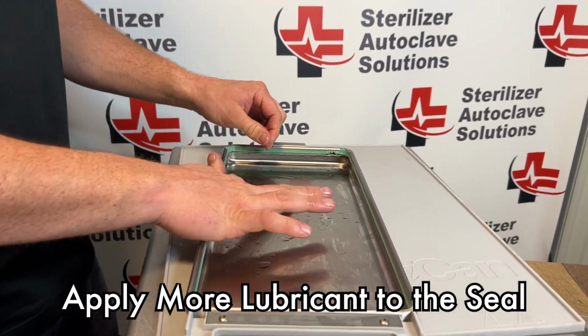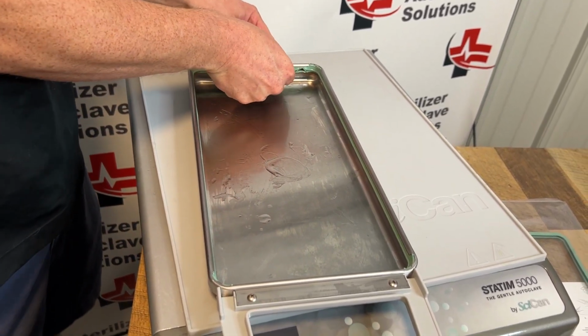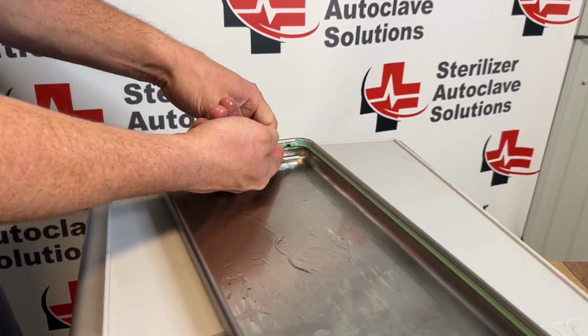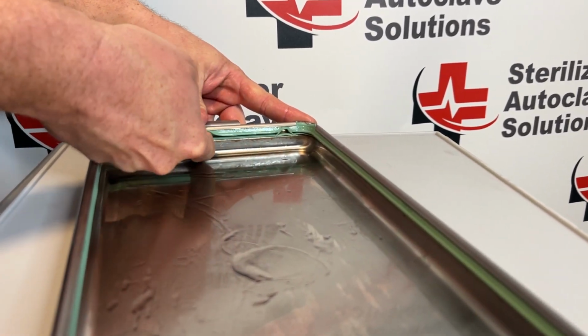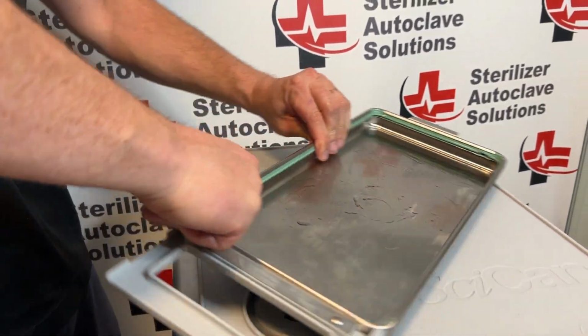Once all those are done, I'm going to re-lubricate my finger with some of the oil that was left in the cassette. I'm going to separate the grooves in the cassette, and I'm going to go all the way around, pressing up. This will help seal and set that.